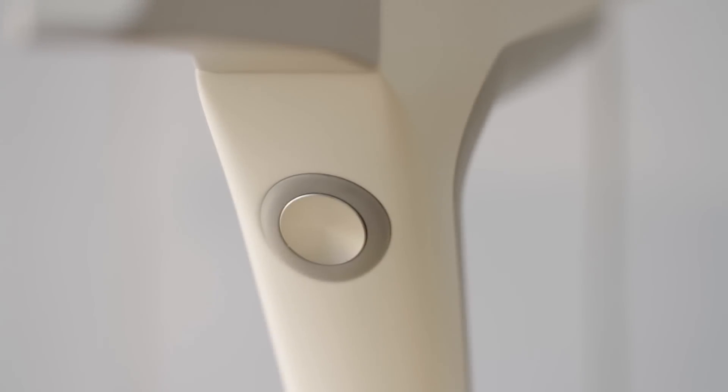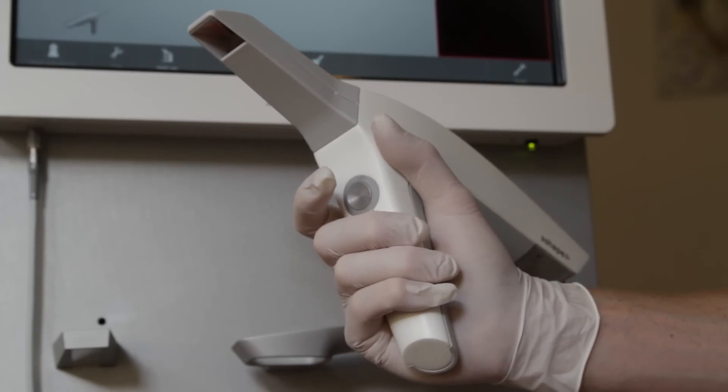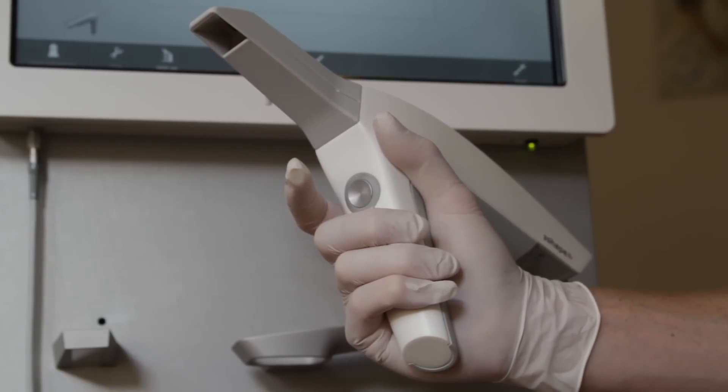The trigger on the scanner has two functions. Click to start scanning and click again to stop. No need to hold the button down when scanning.